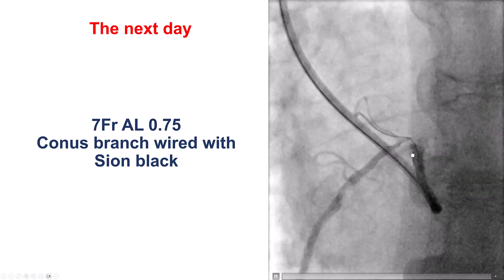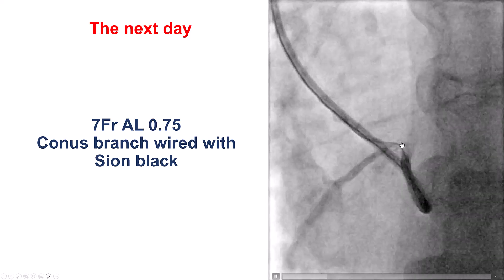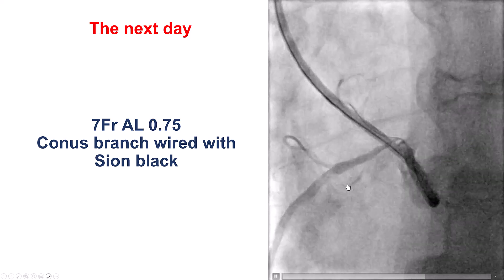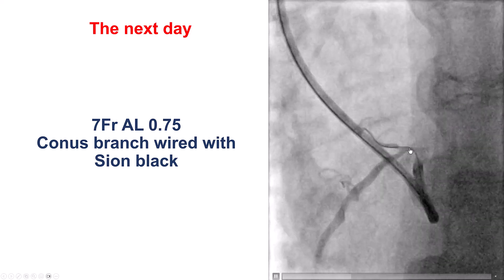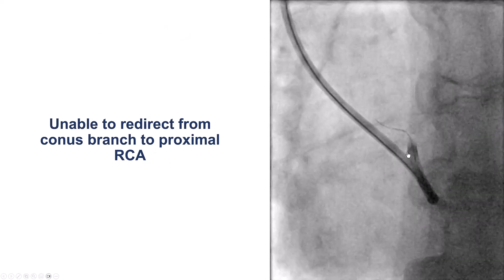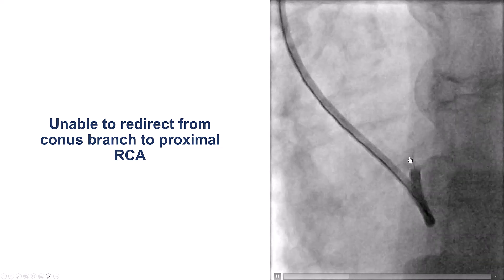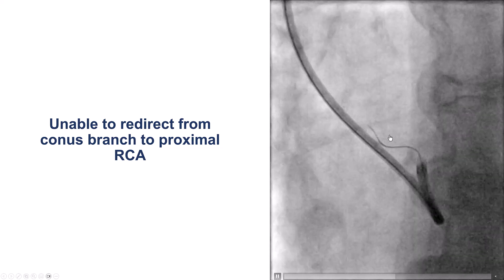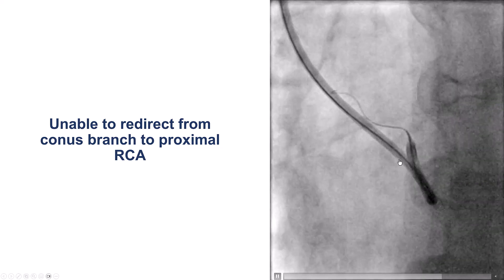Our initial thought was to use a dual-lumen microcatheter over the conus wire and then advance the wire into the RCA. However, this was difficult to do and there was not much support, so we could not advance the dual-lumen microcatheter. It took quite some time and multiple attempts. We tried to redirect the conus wire into the RCA, but every time we withdrew and re-advanced, the wire kept going into the conus branch.